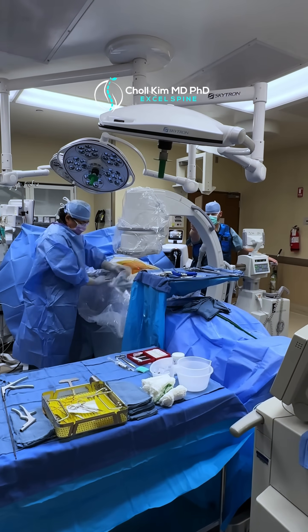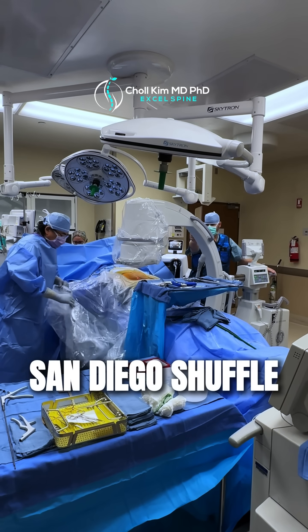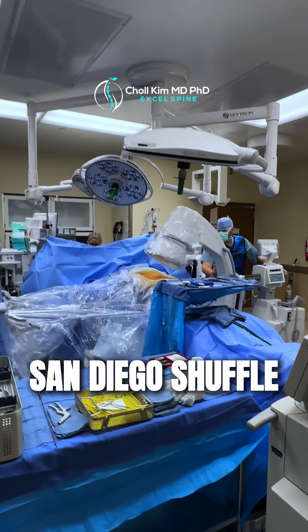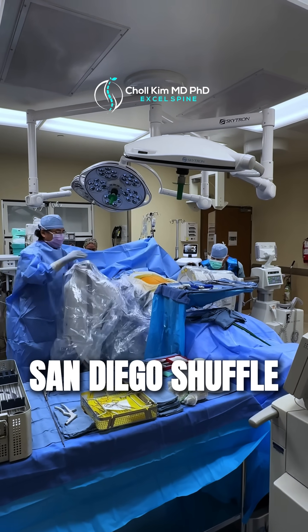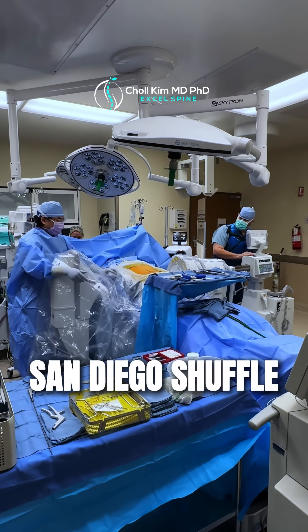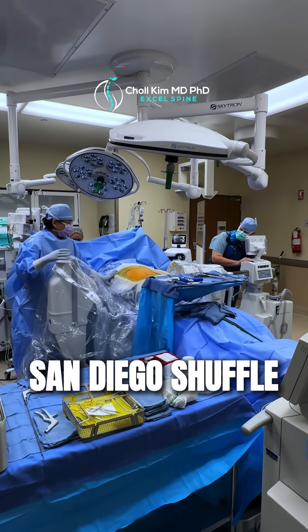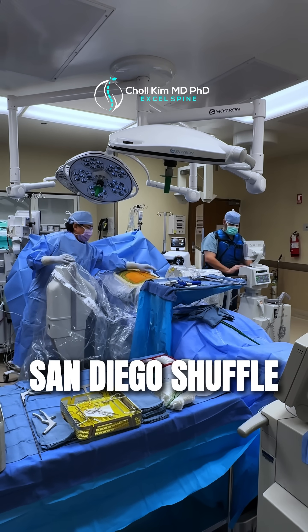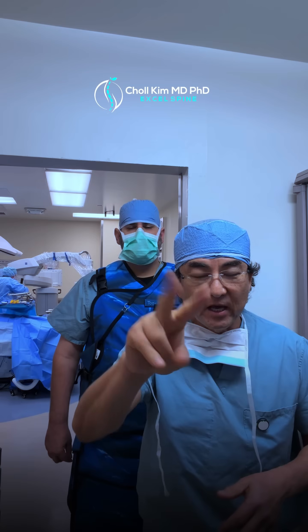The second thing we want to show you is the San Diego Shuffle. When you're looking to see something that is maybe half a millimeter difference, the best way to do that is take two pictures and then shuffle them back and forth really quickly like an animation, and you can see tiny little differences.